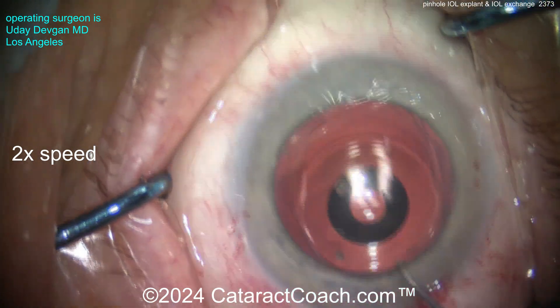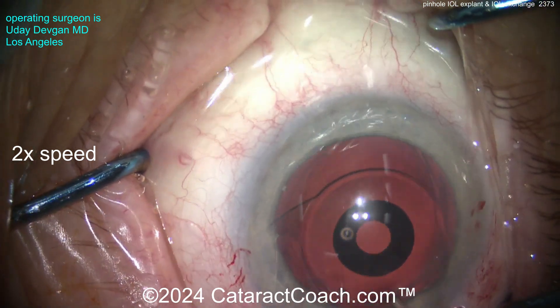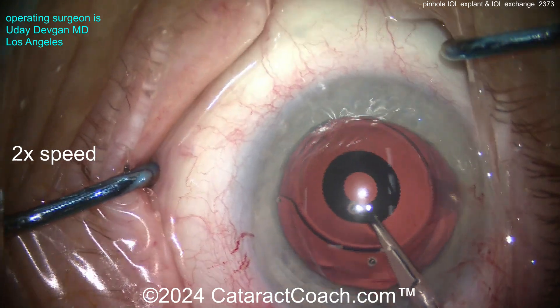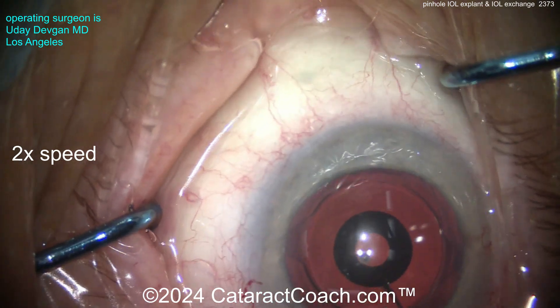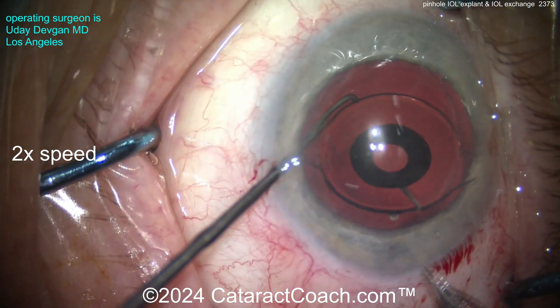I want the entire lens up in the anterior chamber — and here it is, the entire lens up in the anterior chamber. Now we can remove it. The twisting-out technique is not great here because the lens is extra thick and doesn't twist as easily, so I'm going to elect to use micro scissors and just cut the IOL.